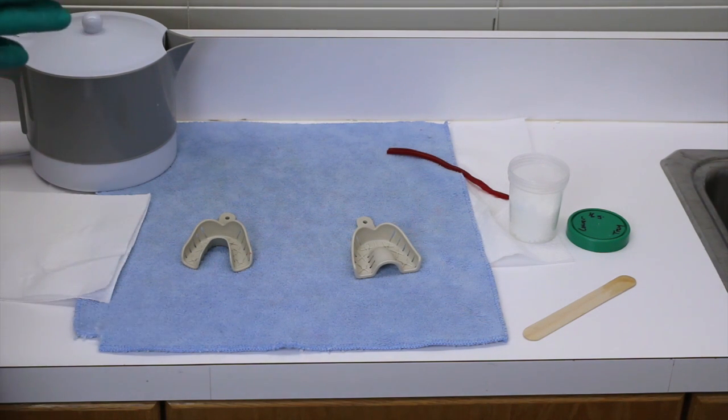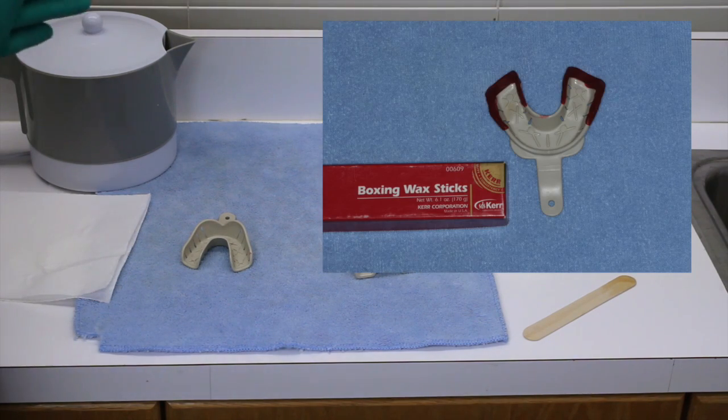Now, common applications where this will be necessary: frequently it'll be done when we have third molars. When you need to extend those trays, when you have those really dolichocephalic types of arches that are really long, you just need to extend those trays a little longer. Occasionally, some patients with extremely deep vestibules will want some extensions there. However, using the alginate in the manner we're going to show you really does not require vestibular extension very frequently. But let's show you how it's done just in case you want to do it.